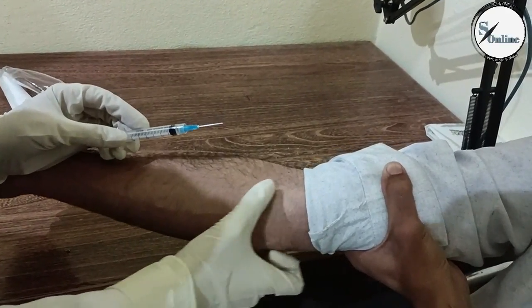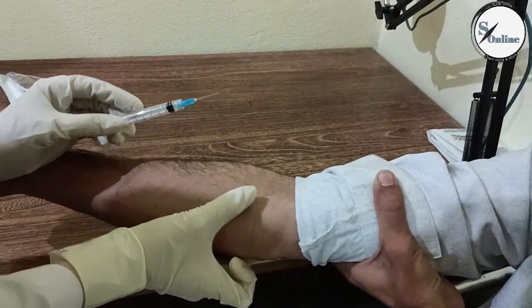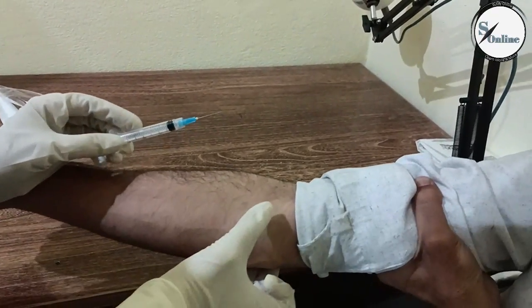It is very necessary to take blood samples in nursing. At every place, we are asked to take blood. Investigations are our work.